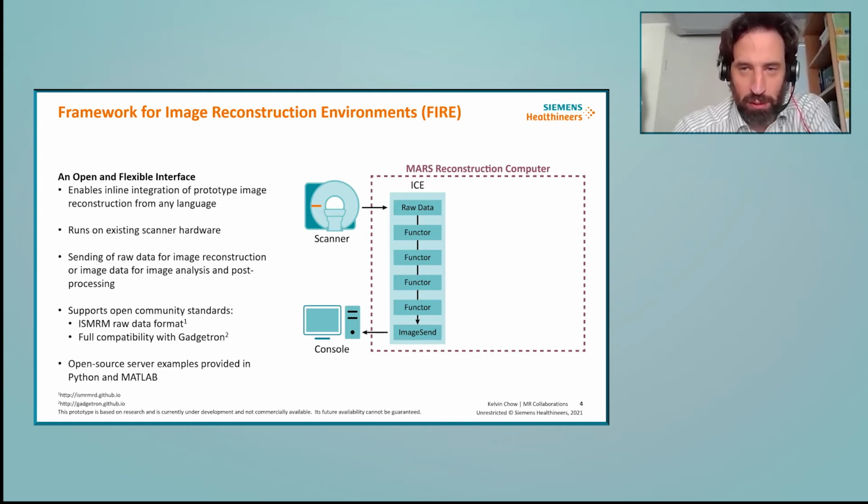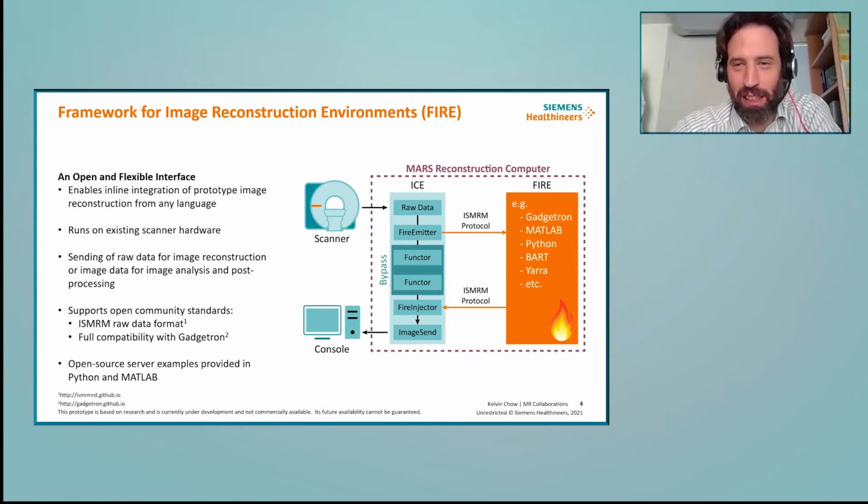This is a figure that is very similar to what Valerie showed, but it's with FIRE. So FIRE is indeed just a protocol that interfaces you with the ICE reconstruction. It's basically how it works: at the scanner you add an ICE program on top of the ICE program that is run with the sequence, that puts an emitter and an injector in your pipeline.